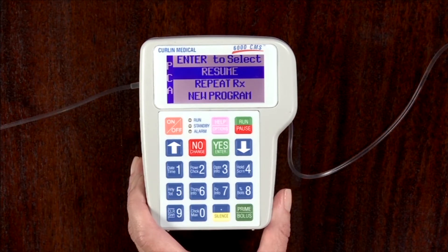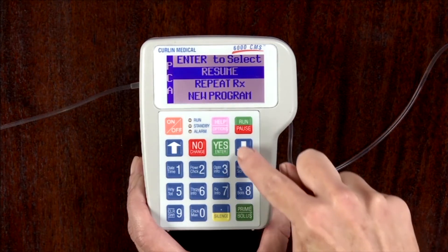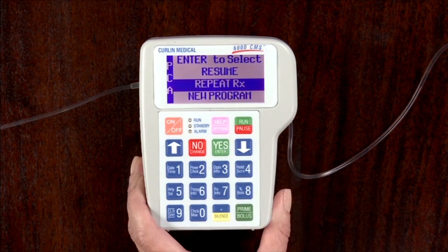The pump will display two or three options to choose from. Select Repeat Rx when hanging a new bag. Resume is selected only when an infusion is to continue where it left off. New Program is selected when setting a brand new therapy.